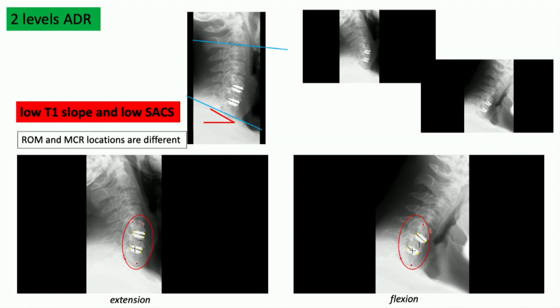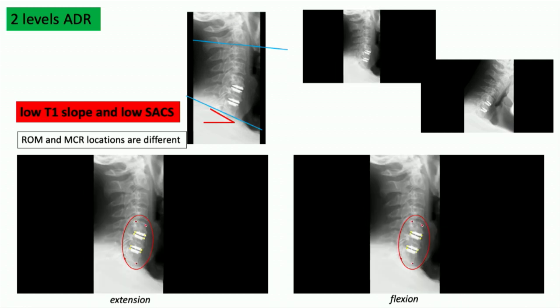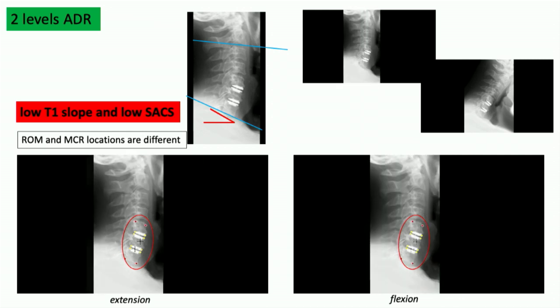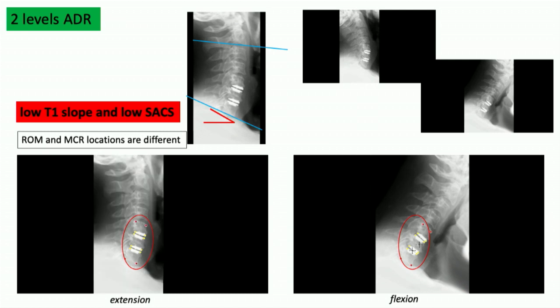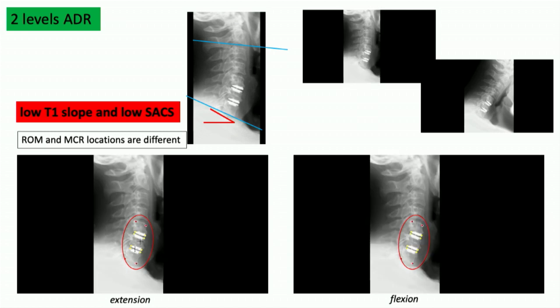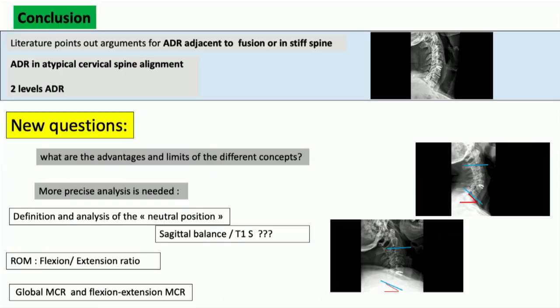Another case, and you see with those two prostheses, the centers of rotation are not where we expect them to be. Look at this. One of the prostheses is a slave of the other. One has a normal, expected center of rotation, and here, this center of rotation is inside of the prosthesis. Probably a case of failure or abnormal evolution.